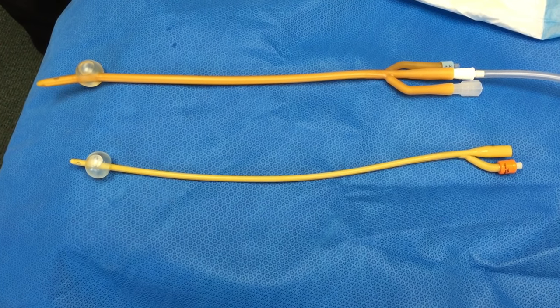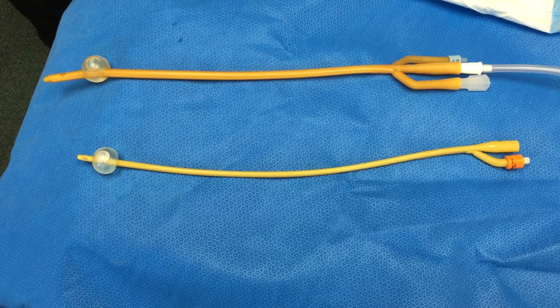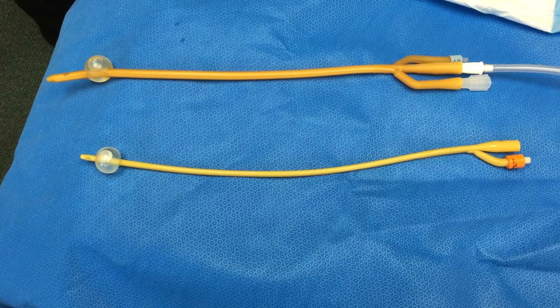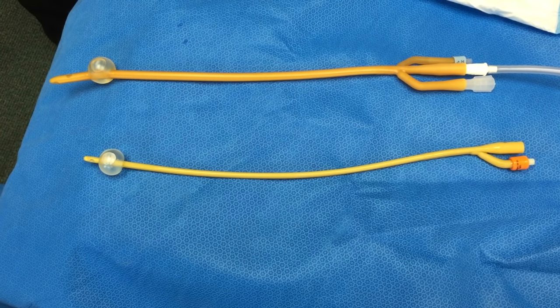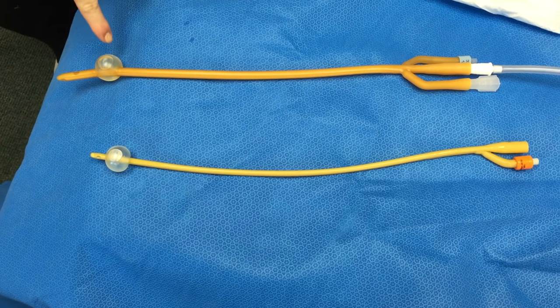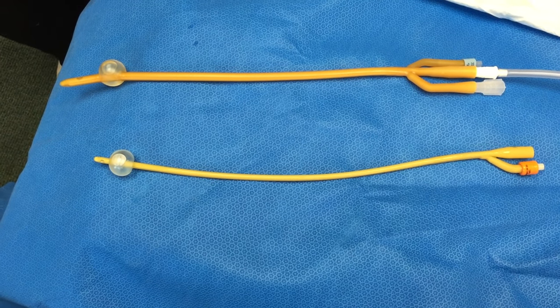In this video, we describe proper technique for removing a Foley catheter. Very briefly, we want to go over the design of a catheter system. You'll notice that every catheter has a balloon at the end of it. This is located within your bladder, and it's holding the catheter in place so it doesn't slide out.